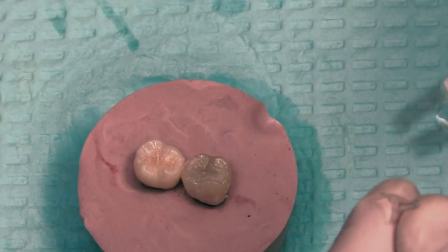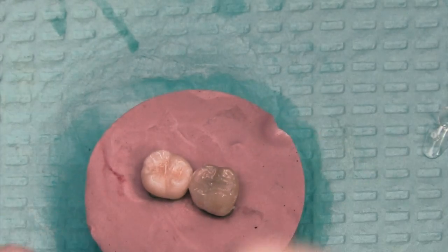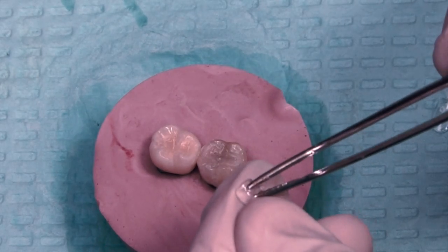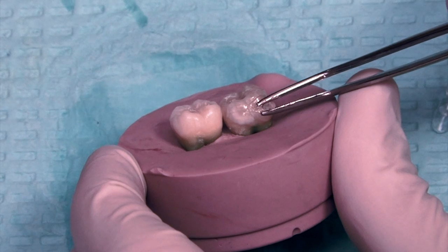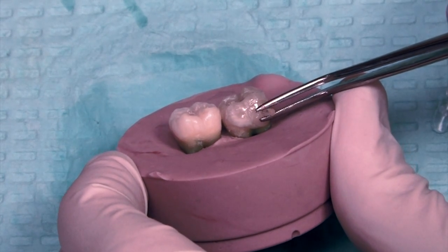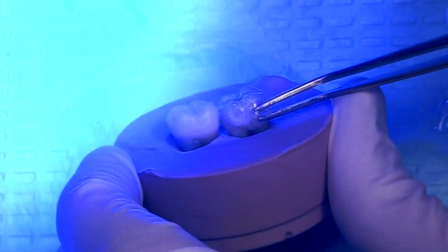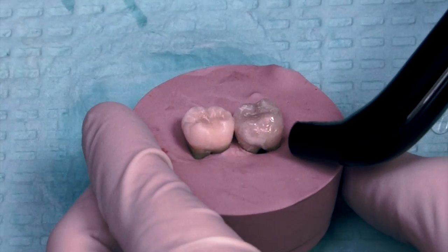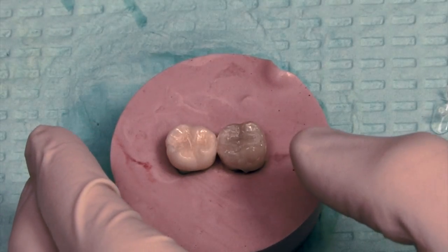Let's try the small matrix and see if it will cover up the entire surface. Usually I run the curing light, but in this instance I'll have the assistant cure while I take and press into the tooth. Excess oozes out. The assistant comes in and cures. Everything is held still. Then I'll remove that matrix and go back again and cure, just because my instrument may have cast a shadow that could have prevented some of the material from being completely cured.